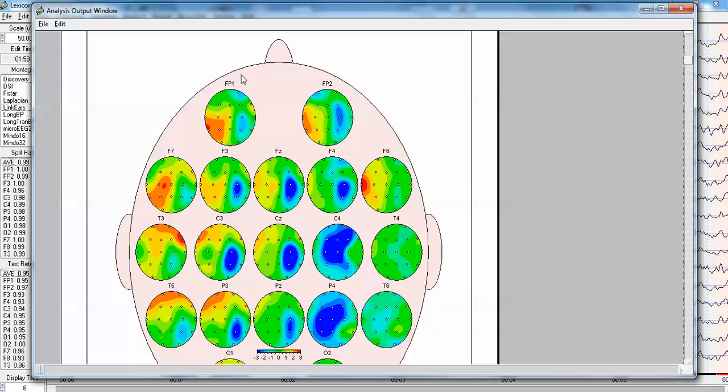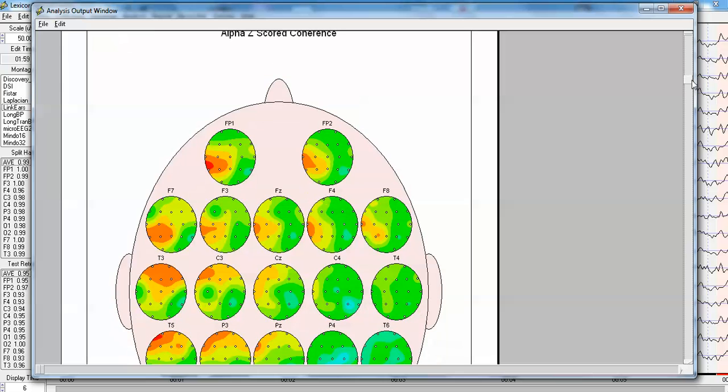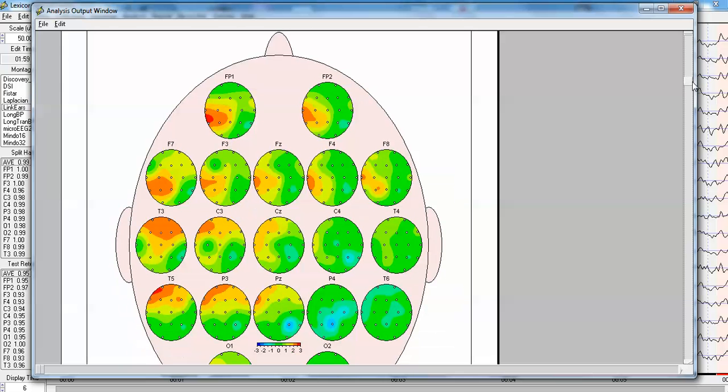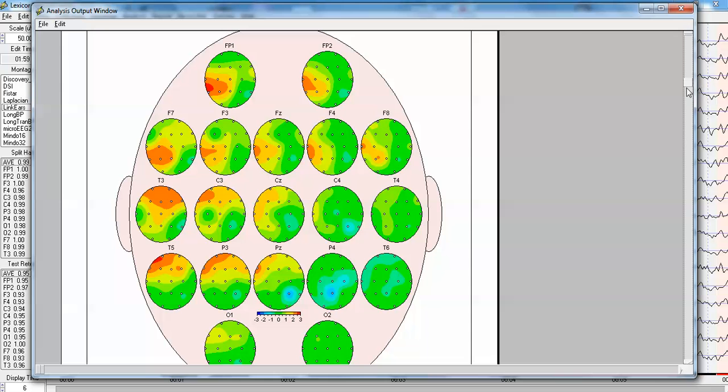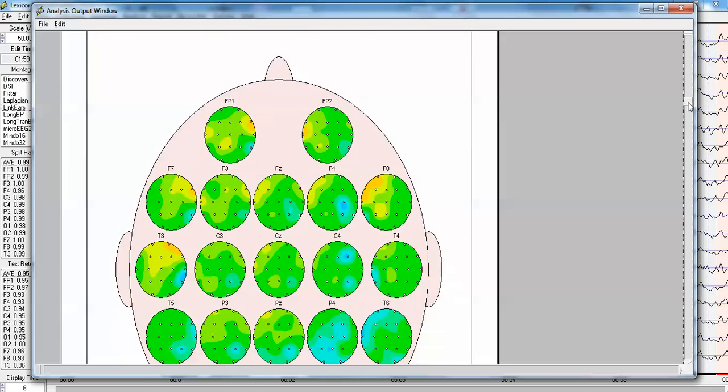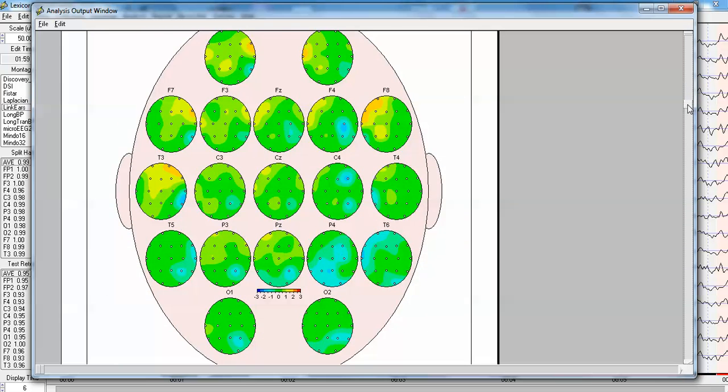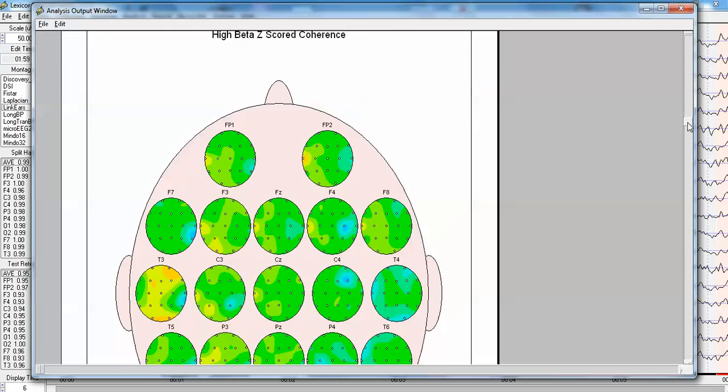As we move to other frequencies, we see that there's less deviation from normal, although there is hyper connectivity, again, frontal lobe to the temporal lobes and the parietal lobes on the left. As the right side is reduced connectivity, and has not much functional connectivity to other parts of the brain.